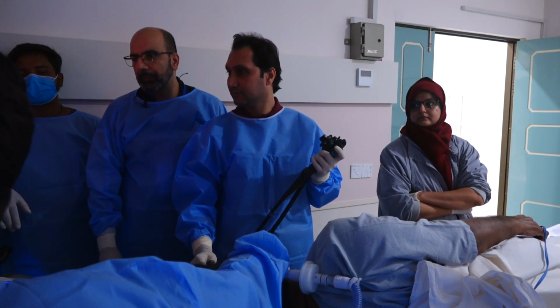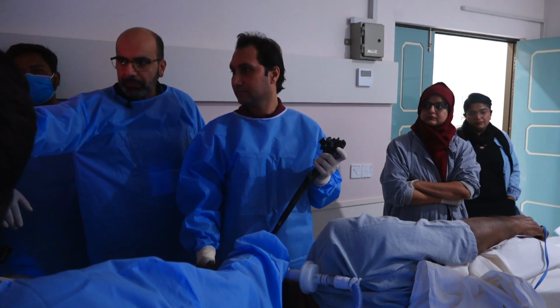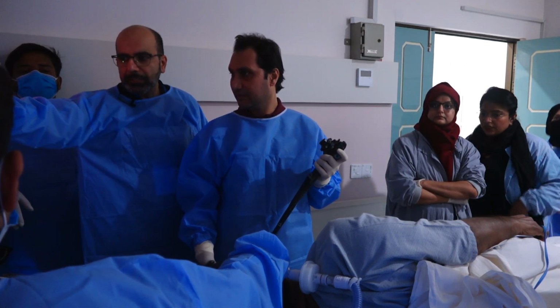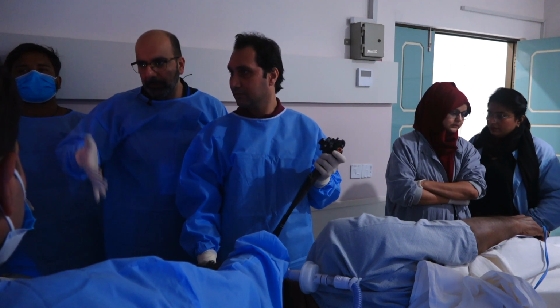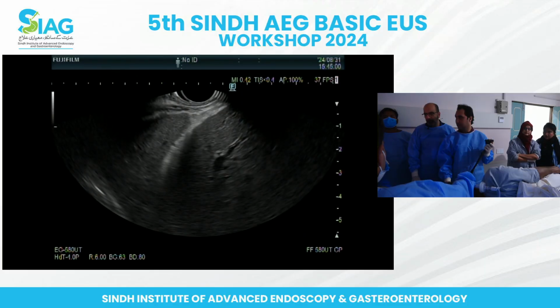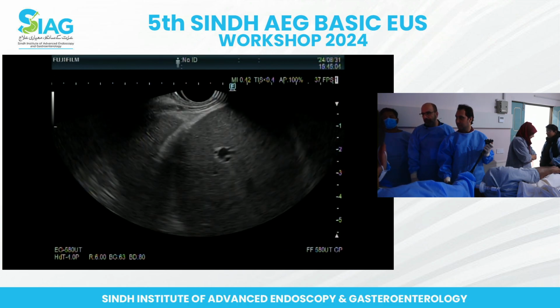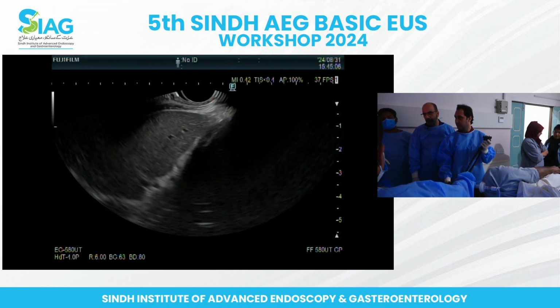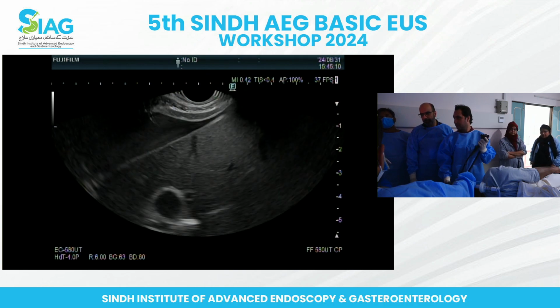I don't see the EUS image. Can we have both EUS and endoscopic suction a bit more? And if you can't suction it, then put the balloon up a bit. And big wheel towards you a bit more. Yeah. Okay, good. Now keep going clockwise. Keep going clockwise. Keep going.